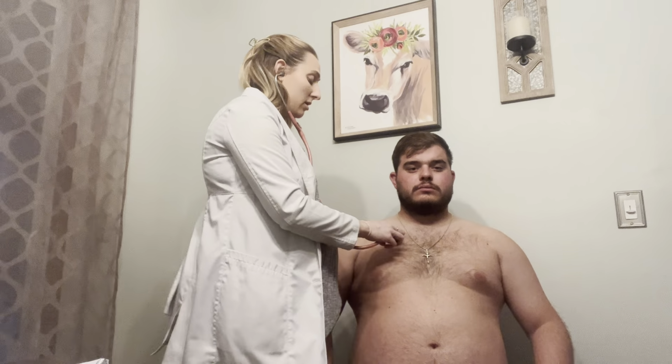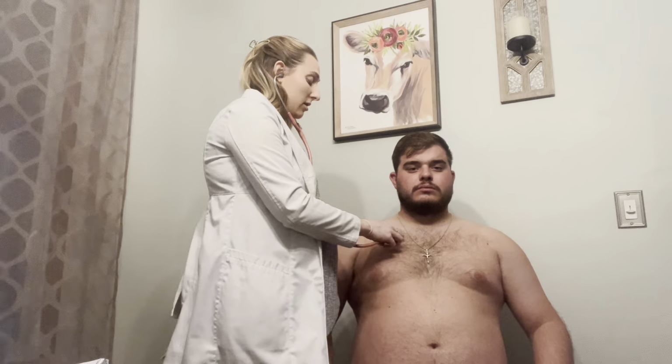And then next we're going to go ahead to auscultating the heart sounds. So I am again going to listen with both the diaphragm and the bell, but I'm going to start with the diaphragm. We're going to start on the right side, on the sternum, on the second intercostal space, which is going to be the aortic area. And on the left sternal border, second intercostal space, you have the pulmonic area.